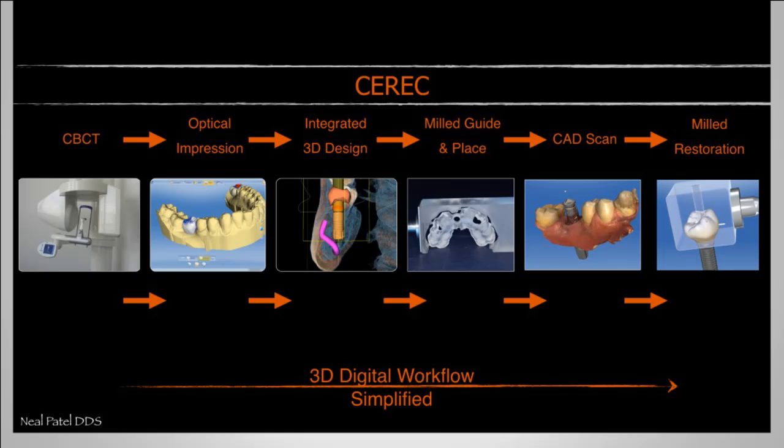Now, I'm going to share with you a simplified workflow, but I need everybody to understand that the traditional methods of loading implants is still something that we honor. So although I'll be sharing a few cases with you where we can immediately load our implants, it is recommended that you wait the conventional 3 to 4 months for osseointegration to occur prior to engaging in restorative treatment.